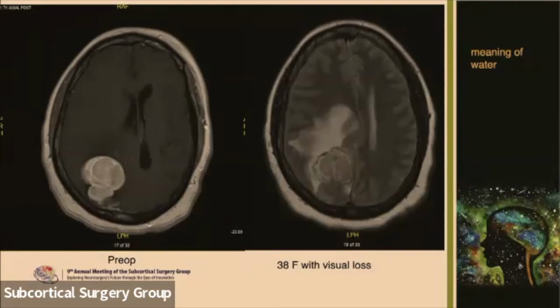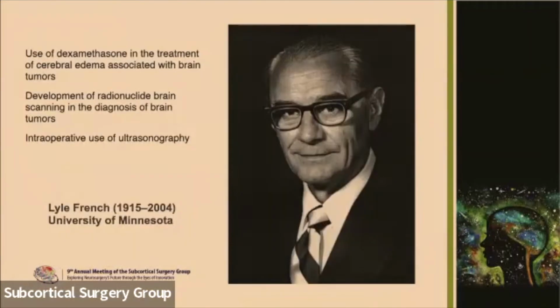So in this hemangiopericytoma, it may represent vasogenic edema, displacement of fibers, and perhaps some immune reaction. In a GBM, it may represent infiltration of tumor growth into the surrounding brain parenchyma. In a hemorrhage, it may represent necrosis and ischemia. And so this entity called edema needs and deserves to be visualized and studied.